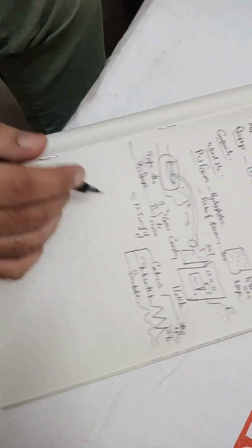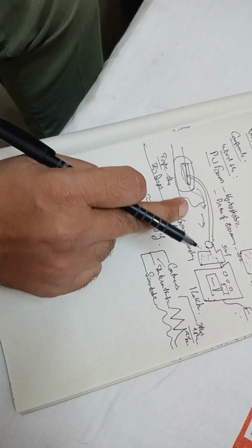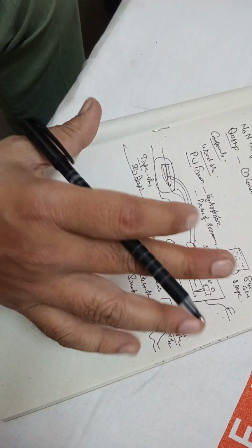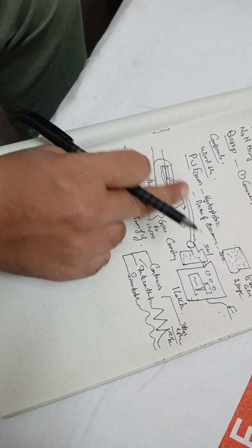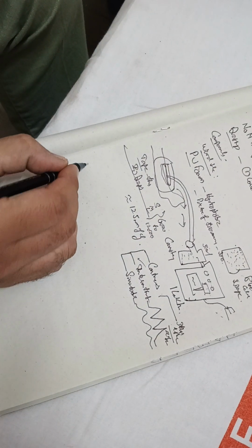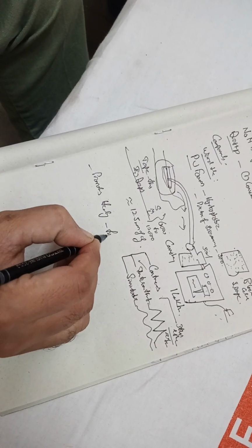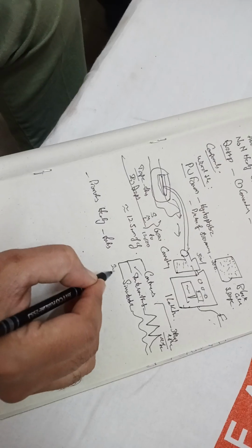So once you have applied that, this keeps on sucking all that exudate, that pus, whatever is there. While doing the dressing, the dressing gets soaked, isn't it? So all those things, soakage will not be there. This will maintain this pressure, so everything will be collected here. So what that will do is it promotes healing faster. The regular dressings might take 2 weeks or 3 weeks.